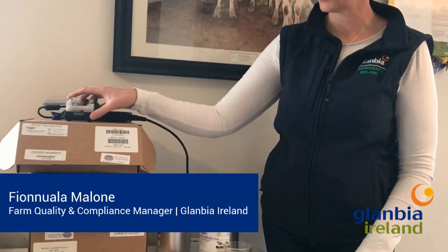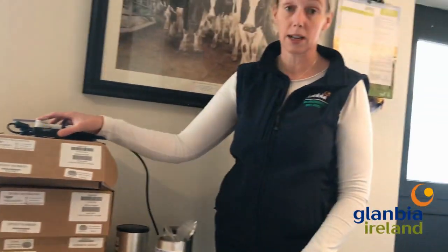Today I'm going to show you how to use an antibiotic kit. These are the very same kits that we use ourselves within the Milk Quality team and also that we use on the sites throughout the country to test milk and in our lab in Dungarvan.